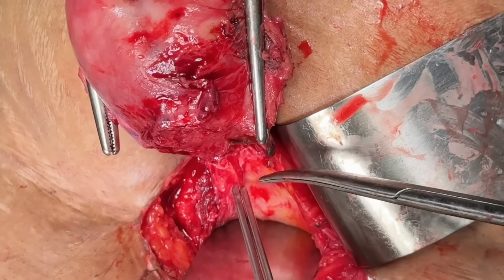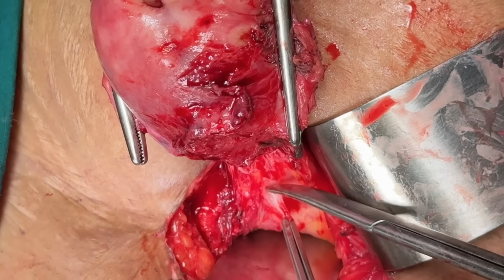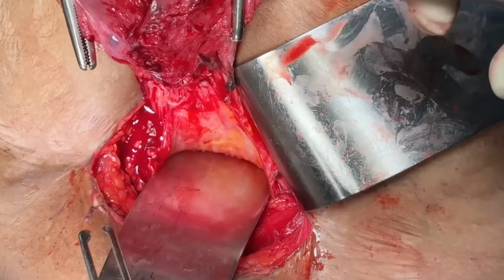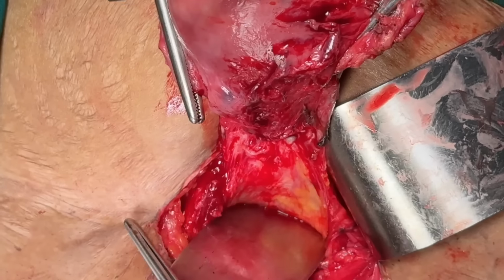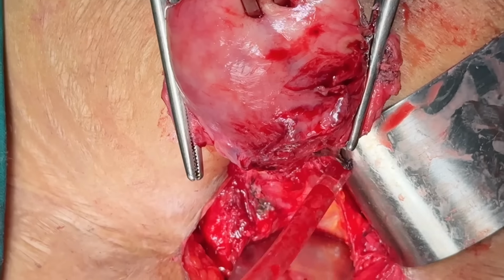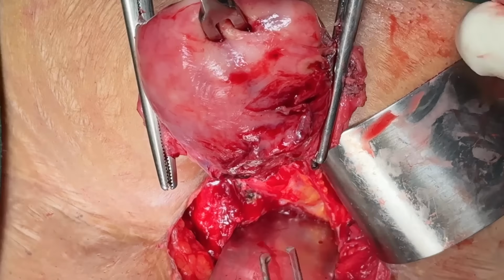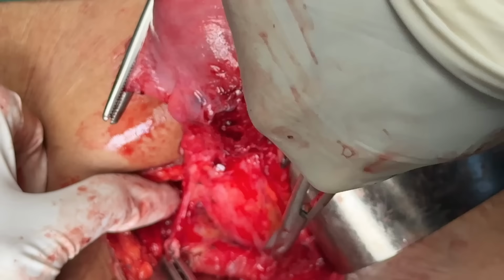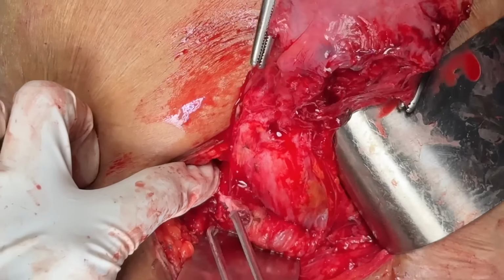Now, can you see? We are in the process of approaching the correct plane, the wide cervical surface. But remember, bladder is very close, so be extremely careful as you go down. But finally, if you dissect properly, I'm sure all of you will get a proper plane.